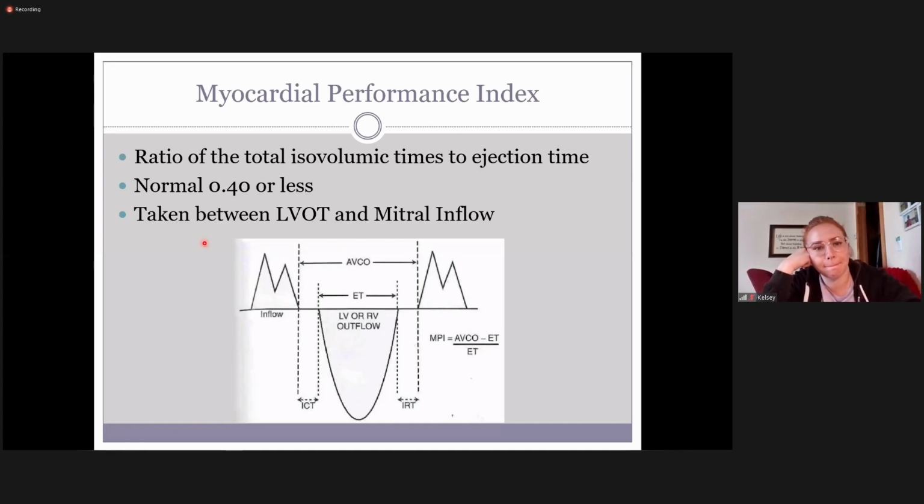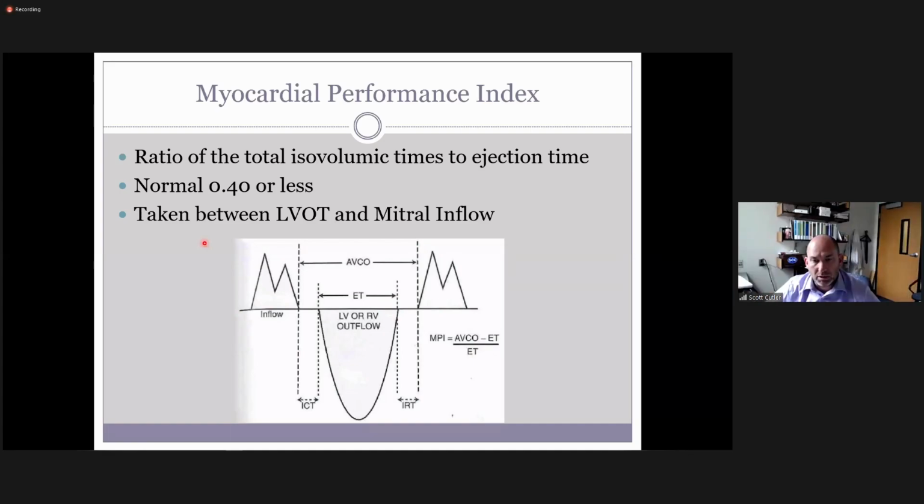Yeah, so an apical perspective has to be the perspective where you actually see either a 5-chamber or a 3-chamber view, because it has to be capturing the flow going out the aorta. If you're using pulse wave, which you can do, just make sure that it's capturing both of those signals. If it's CW, just make sure that your line runs through an area to grab both signals. So it's not super complicated to do. Just make sure that your Doppler is capturing the right area and you can see the waveforms.